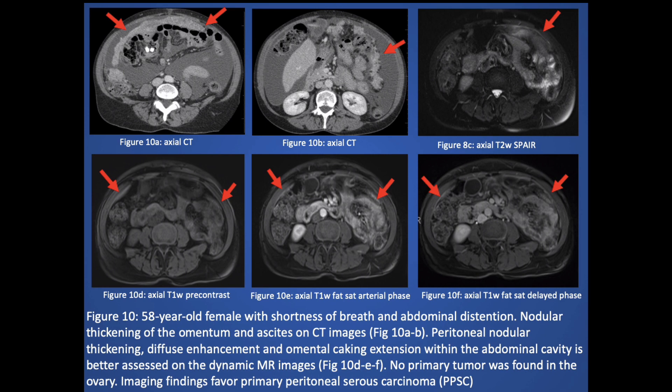A 58-year-old female with shortness of breath and abdominal distension. There is nodular enhancement of the omentum and ascites on the CT images. The extent of the disease is better assessed on the dynamic MR images. No primary tumor was found in the ovary, and imaging findings favor primary peritoneal serous carcinoma.